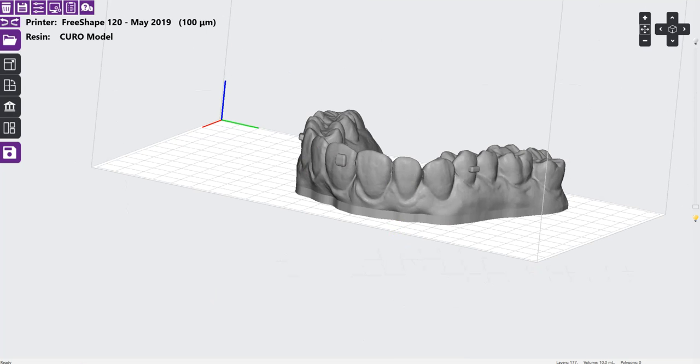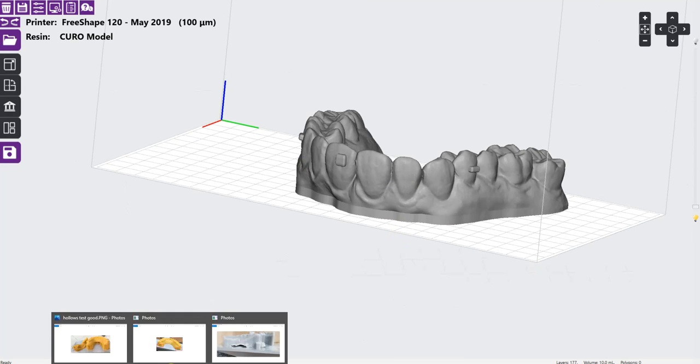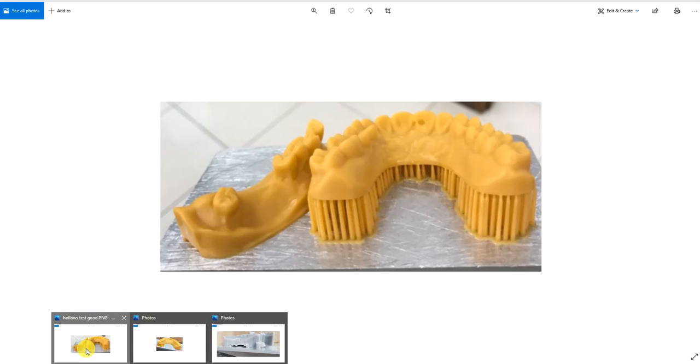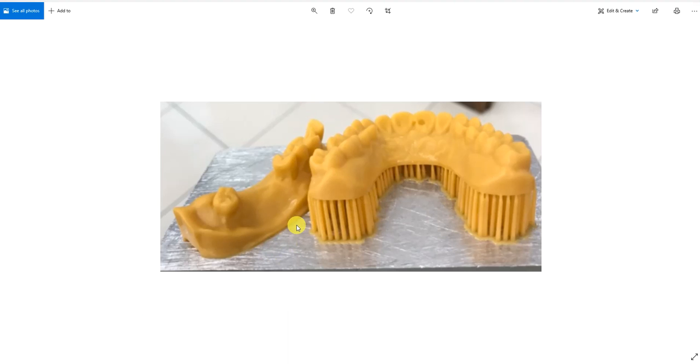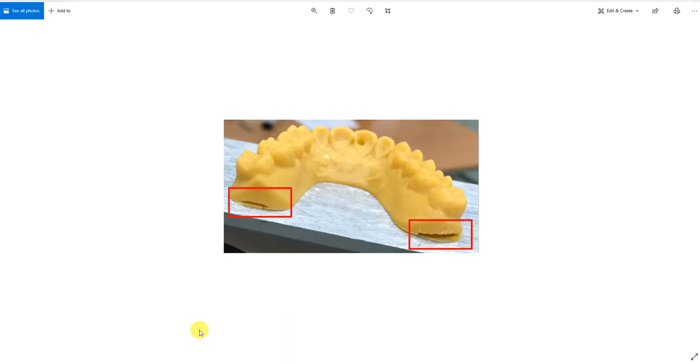These pictures show the results. As you can see, the first print was successful and the second print failed. You can see some holes formed in the model because of the pressure.